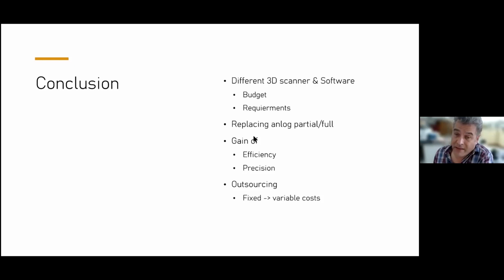In this way, we can gain more efficiency in our lab and more precision, definitely. And it's more reliable. Because if I put something on the mill tonight, like a denture, I can mill it overnight and I come back next morning and it fits.